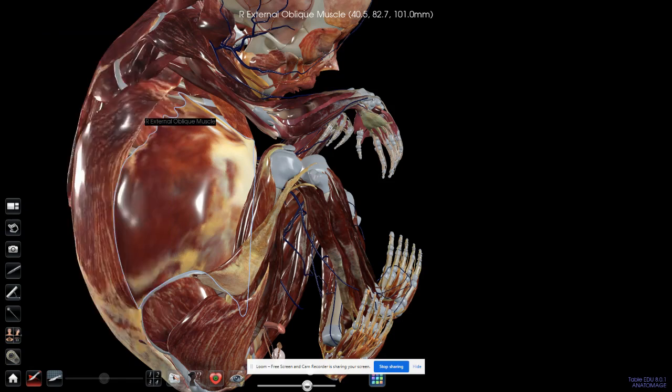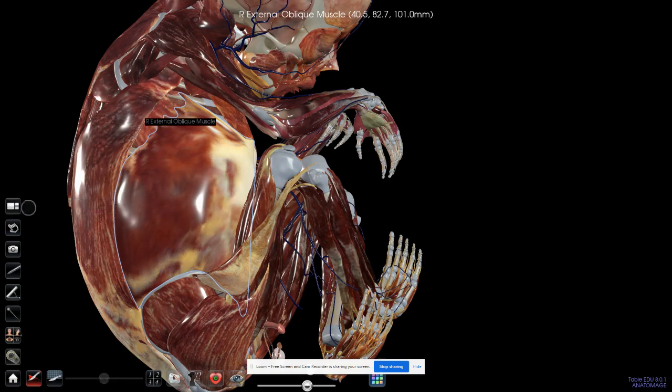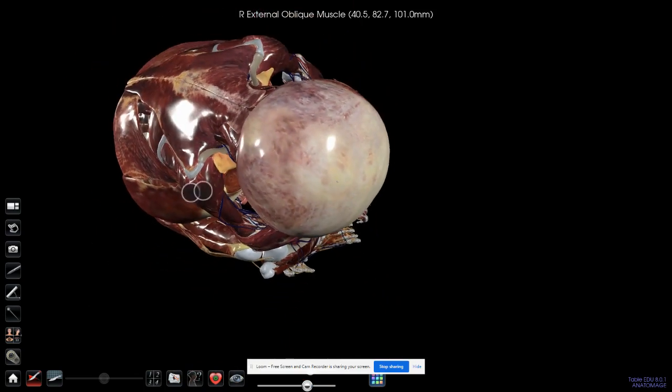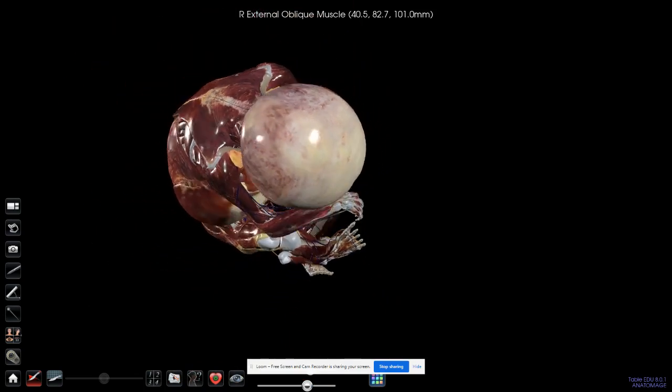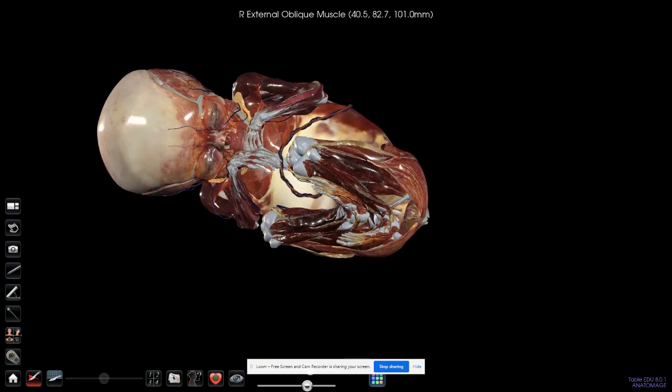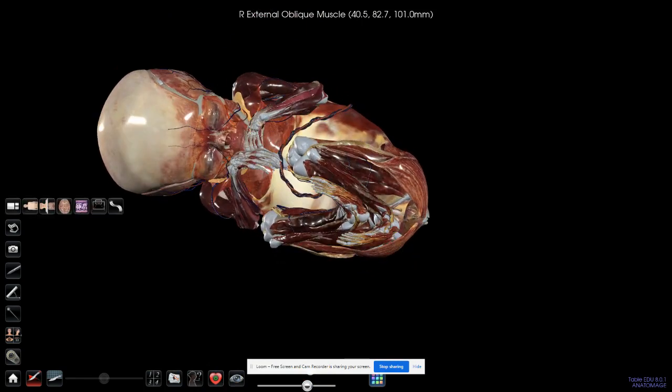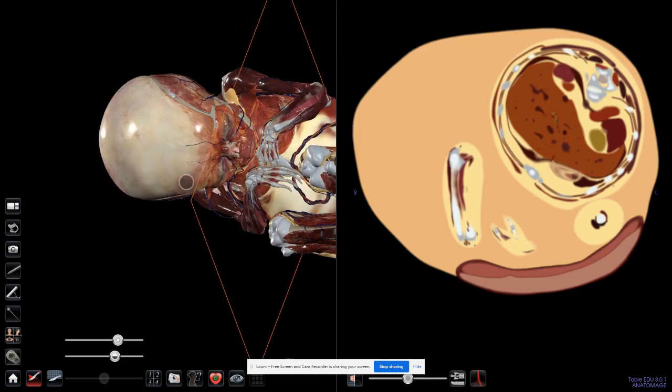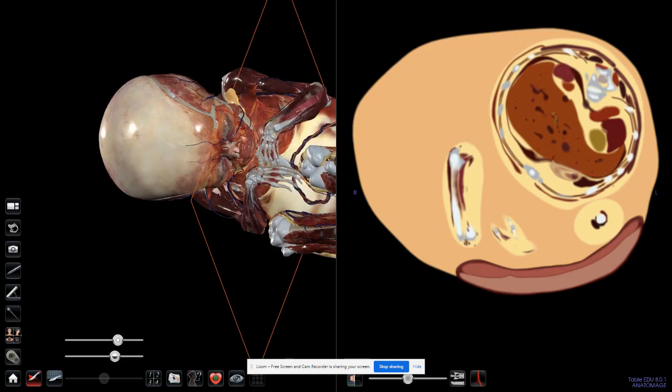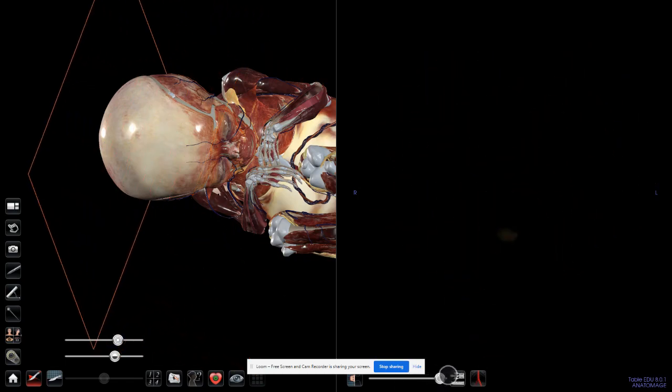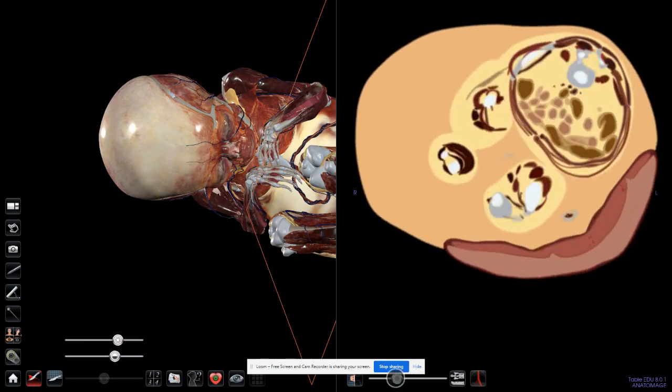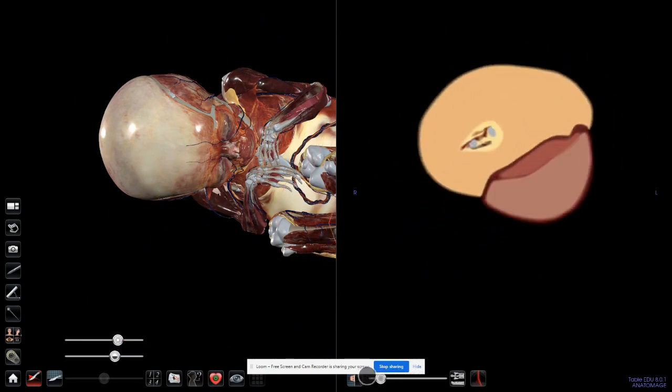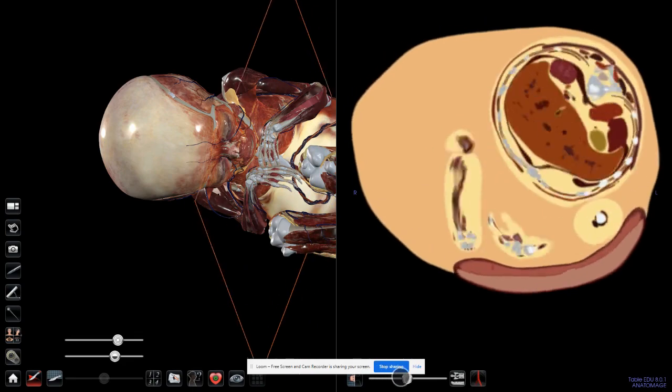After I'm done with my settings, I can start playing around with the knobs. The first knob is just like the cross anatomy, allowing me to see the layout as one piece—this is the square and next to it two smaller squares. Then I have the second knob, which allows me to see the cross section by skimming in and out. As you can see, the orange line is moving across the cross section that I want.